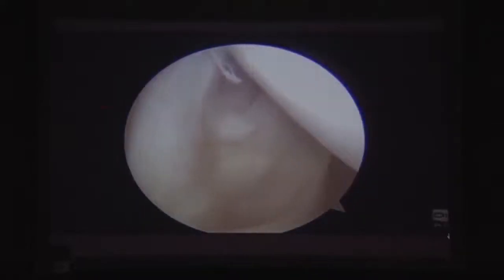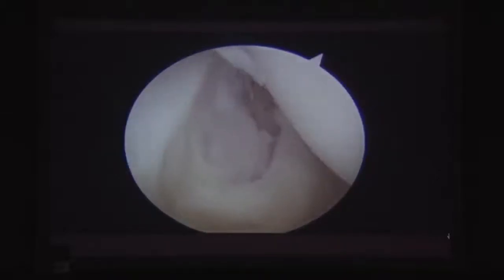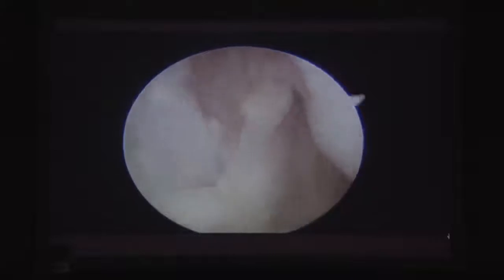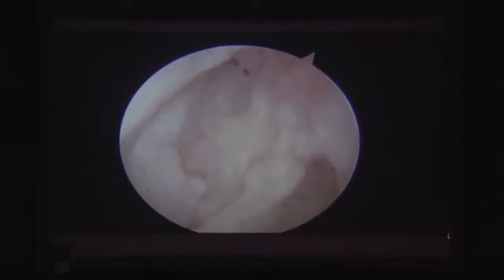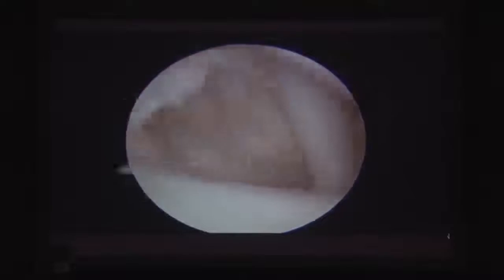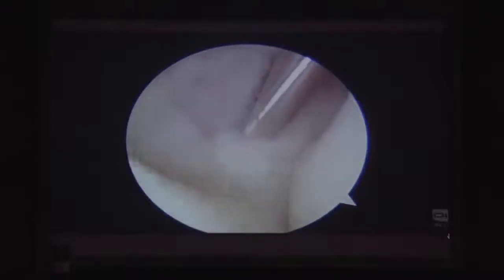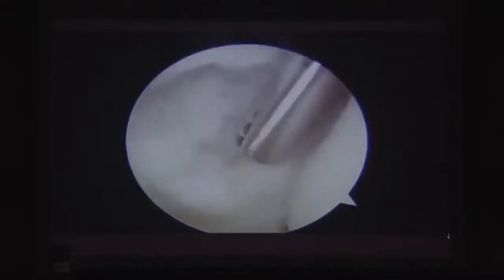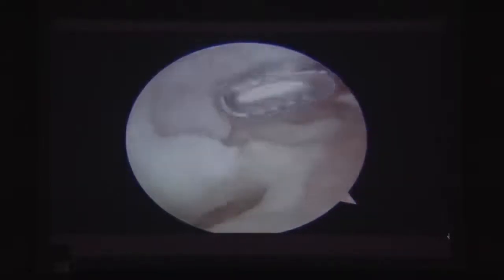Arthroscopically you can visualize the fragment, the avulsed subscapularis, and also significant biceps tendon intraarticular damage — biceps tenodesis would almost always be performed alongside in these patients. The leading edge of the tendon and the crater are identified. Because the case is three months old, thorough debridement of the bone down to fresh bleeding bone is essential, performed intraarticularly. The crater is then freshened.